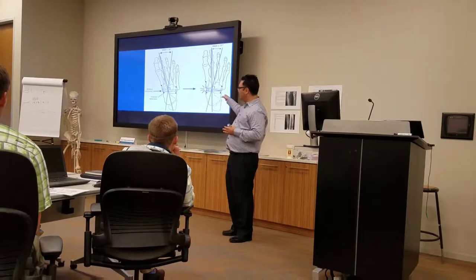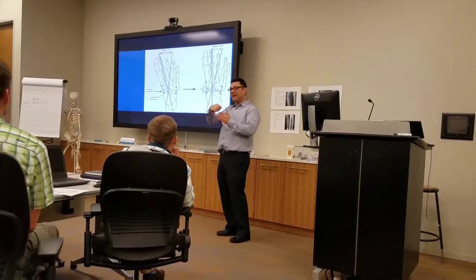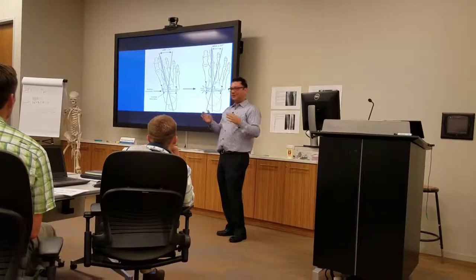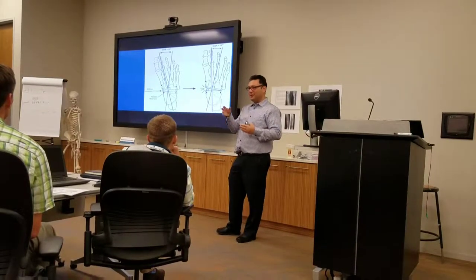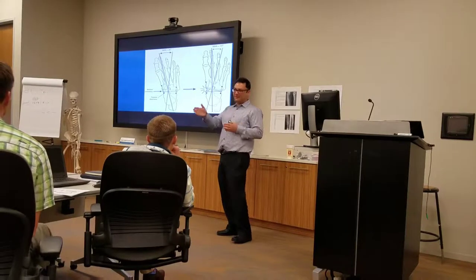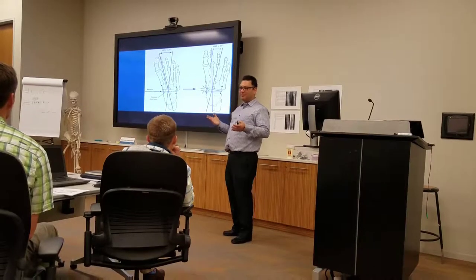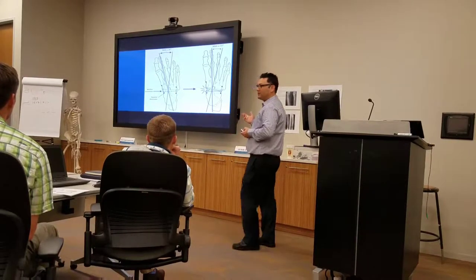A, you have the plantar nerve area that's going to get a lot of stretch on there. B, that foot is tight. Like, you think you're going to just make an osteotomy and open it up? That foot's not going to give you a lot of give. And then once you open it up, it's going to rotate on you. That's not an easy foot. You can open it up and make some osteotomy there, shove in some bone graft, and see what happens. Or you can let the patient's own biology do the work through the gradual correction.